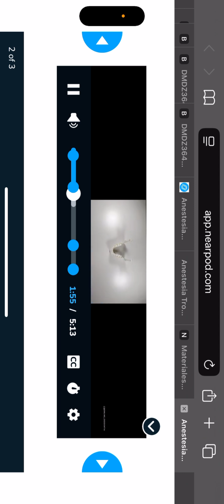The next tip that we can look at is that when you do a block, so let's say that we're blocking the right side, occasionally if you're trying to work on the central incisor or this lateral incisor, you may run into cross innervation, which means that sometimes there are nerves crossing over from the left side of the jaw into this region, and they're innervating the central or lateral incisor of the right side, even though you've already blocked this side. So how we take care of that is basically to do a separate infiltration right at the apex of the tooth in question. Articaine is a terrific anesthetic for this. That will knock out any cross innervation and help to get you through your procedure painlessly.